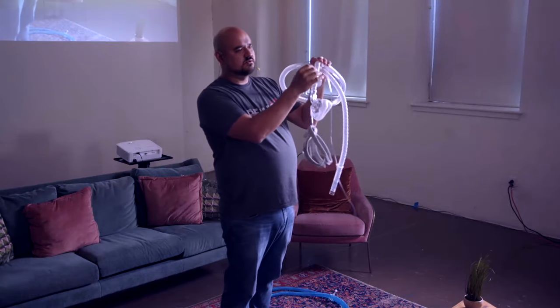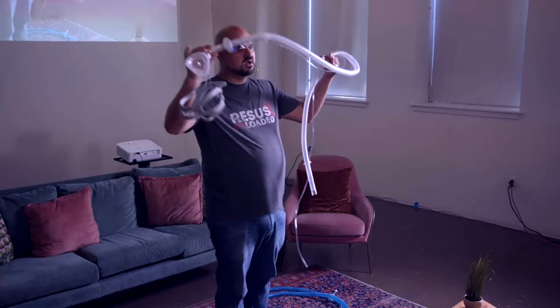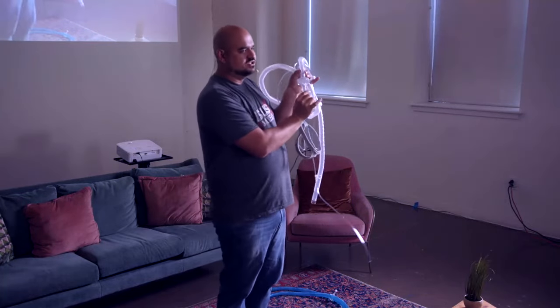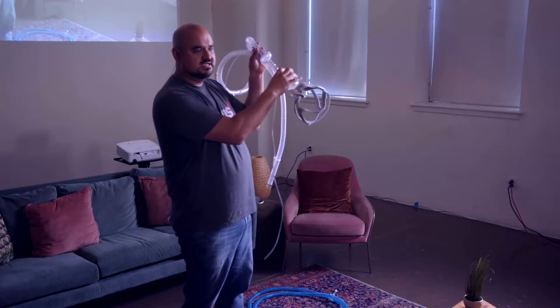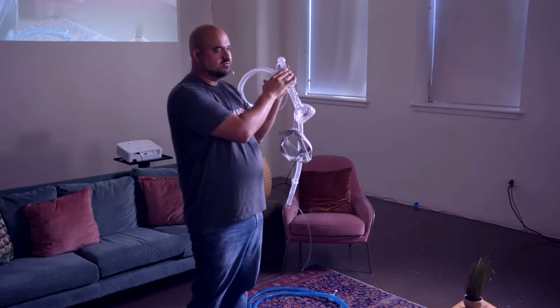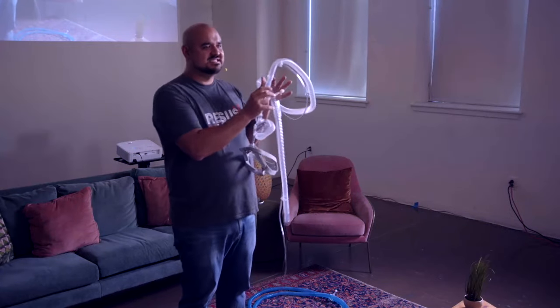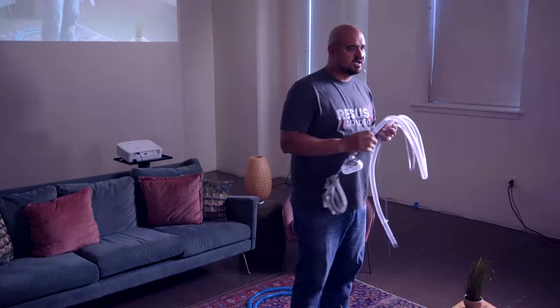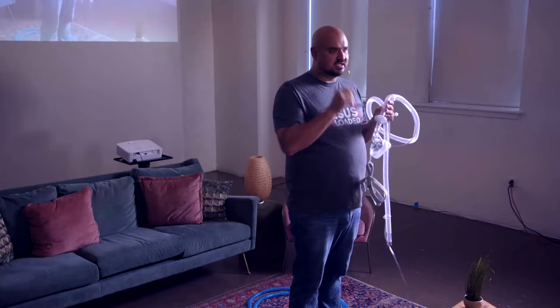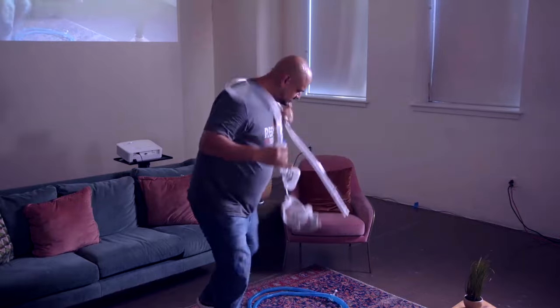Most circuits now come with exhalation ports, but there's a plug that can cap them. There are still some non-invasive circuits out there that do not have an exhalation port. If you have a non-vented mask and a circuit without an exhalation port, you are going to torture your patients — and I have seen this happen. As physicians, we are responsible for this; make sure your patient has a functioning exhalation port.